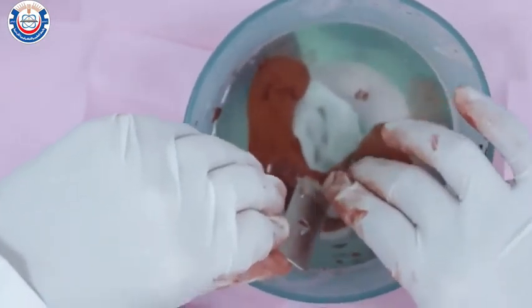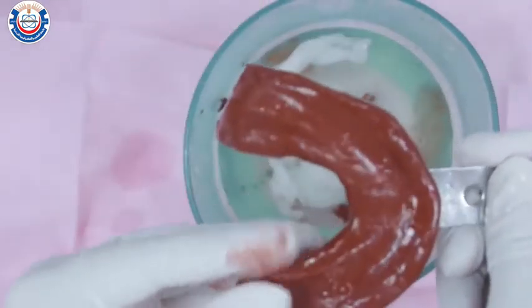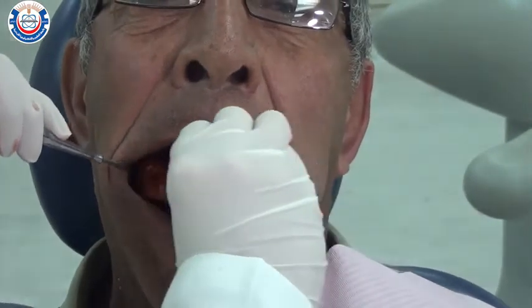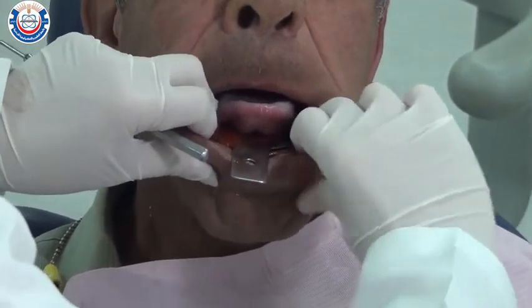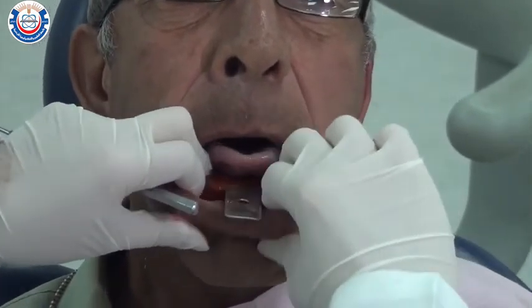Reheat the material one last time before introducing it to the patient's mouth. Stand in front of the patient and introduce the impression compound-containing tray into the patient's mouth. With your non-dominant hand, use a mirror to retract the cheeks, and with the end of the tray itself, retract the cheek on the other side. Center the tray over the center of the ridge and gently retract the lip to make sure that the material has reached the full depth of the sulcus.